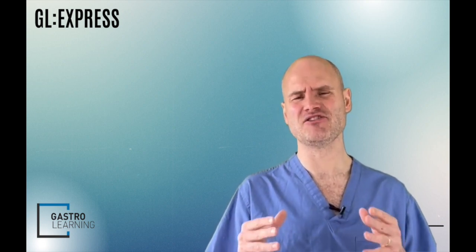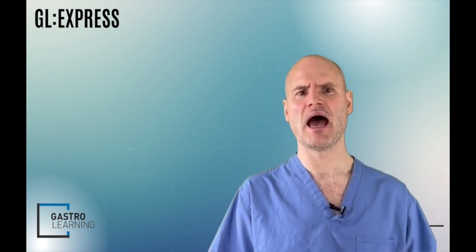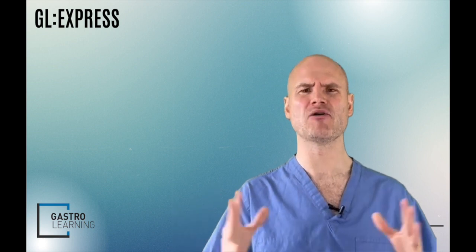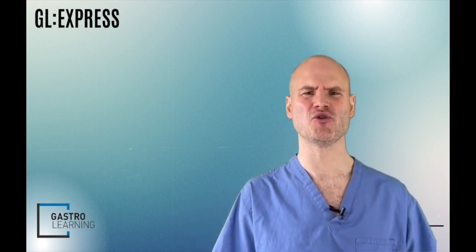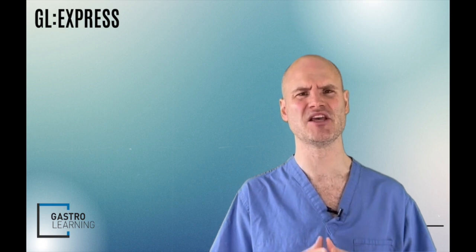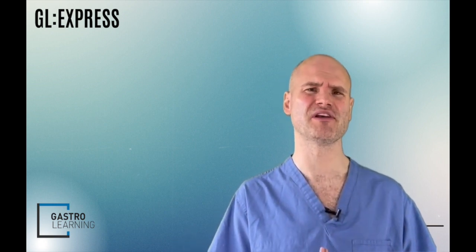So what does this data tell us? Well, it tells us that these new intraductal fully covered metal stents are equally as effective and safe as the multiple plastic stent approach. And this effectiveness includes both initial stricture resolution and also long-term outcomes in terms of recurrence. Importantly, it addresses the burden of the multiple plastic stent approach, where patients now have to come for fewer ERCPs, which means patients are exposed to fewer risks, and it takes fewer resources out of the healthcare system.